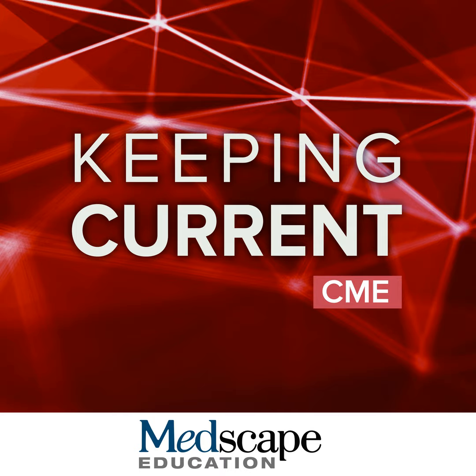This is mildly T2 bright. That's a scary bright. Hepatobiliary phase defect and has diffusion signal. So this would be a positive abbreviated MRI.